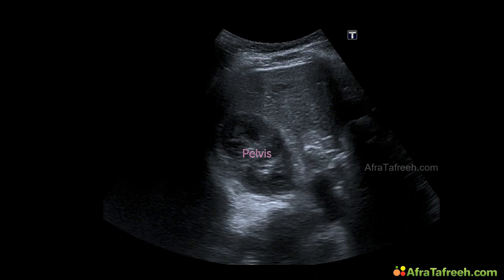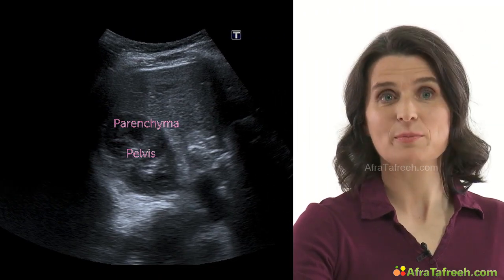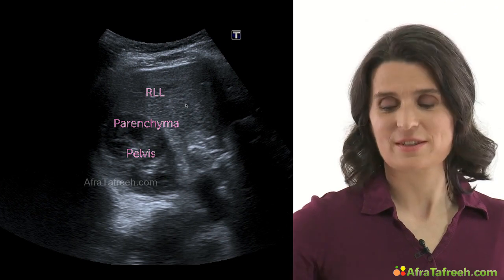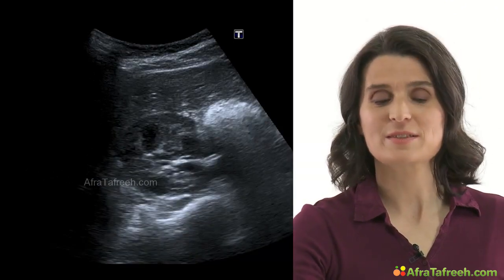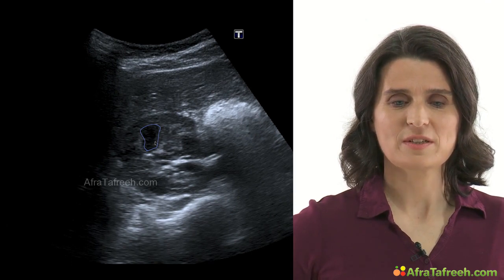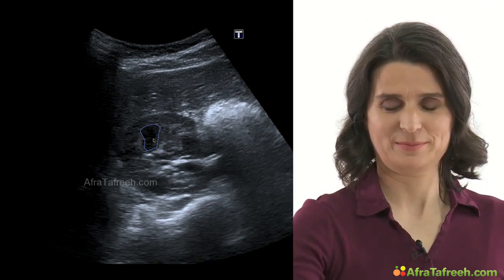Again, the renal pelvis in the center, the parenchyma with its marked pyramids around here, and the right liver lobe as an adjacent structure. Again, in the next picture, we can see the renal pelvis, the parenchyma, and here a beautiful marked pyramid.